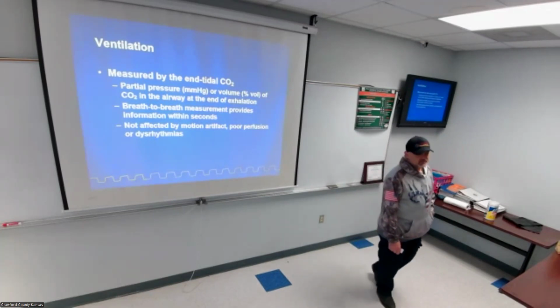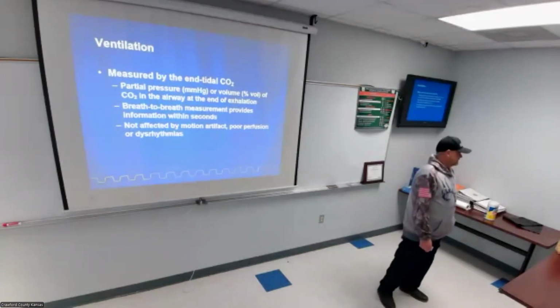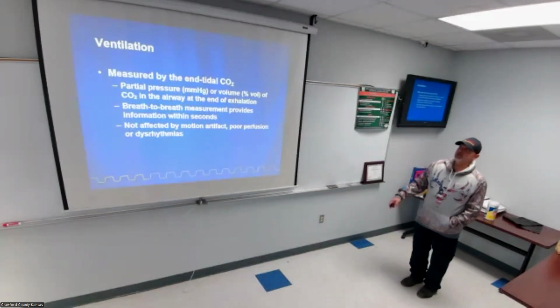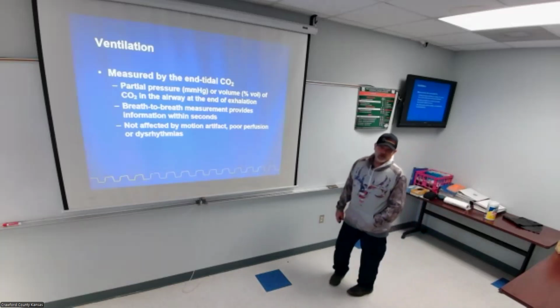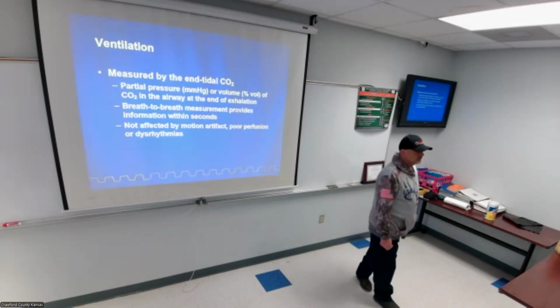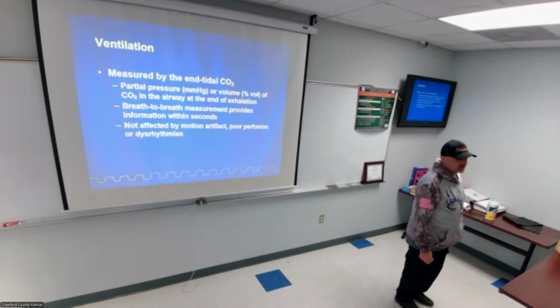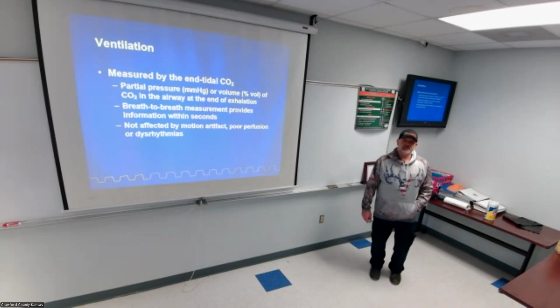I think one of our biggest problems up here is cold fingers. Especially this time of year, you just can't get good saturations on them. Another thing I'd like to talk about real quick before we go much further is our nasal cannulas. I haven't found a really good way for the nasal cannulas to actually read correctly. I don't know if anybody else has. I would love to share it, because I tried everything under the sun. Anybody have any ideas how we get these nasal cannulas to read correctly?